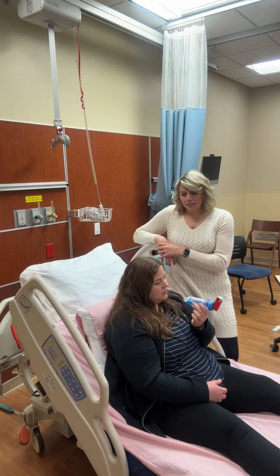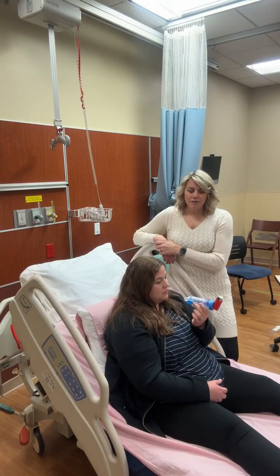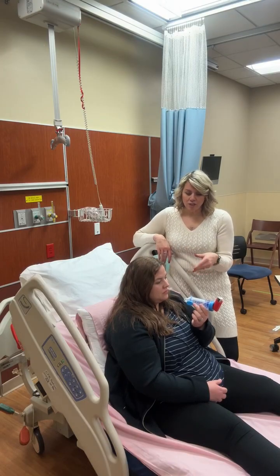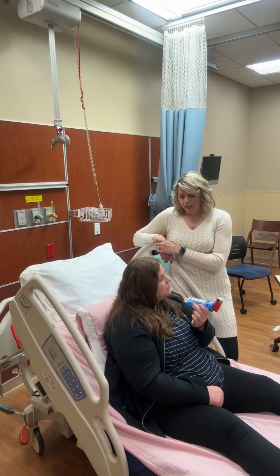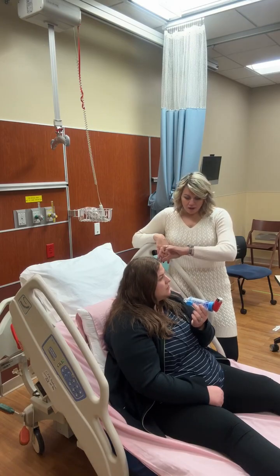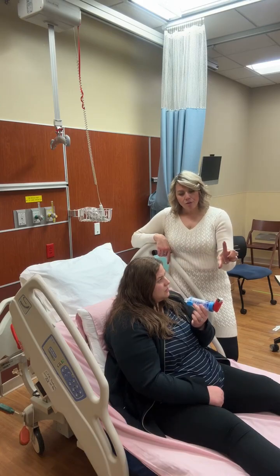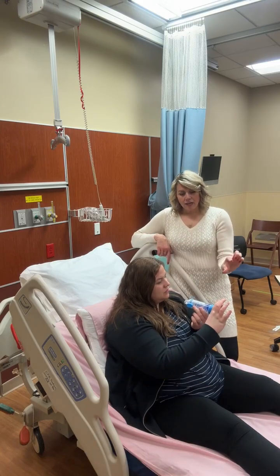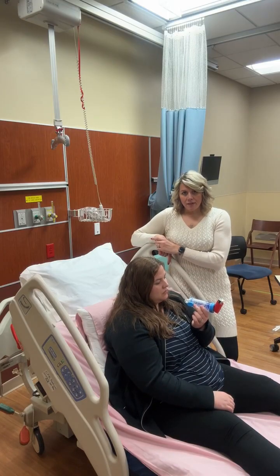We're just going to wait a minute and see how you feel. You let me know if you're feeling really jittery. This is a fast acting medication, so it should work really fast. And like I said, people do feel jittery. Sometimes they get a headache from it. After about a minute, we're going to do that again. The instructions are to push down the canister, allow the medication to fill the chamber, put it in your mouth, and then repeat your breaths just like you did last time.